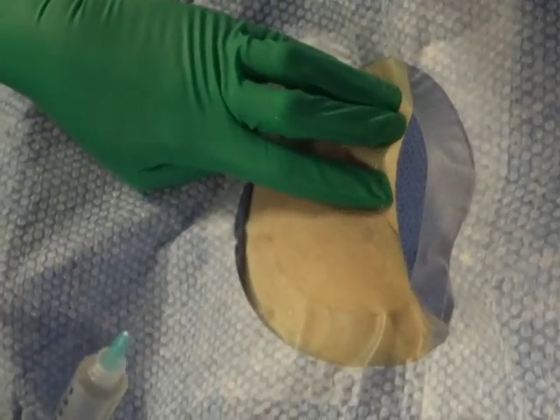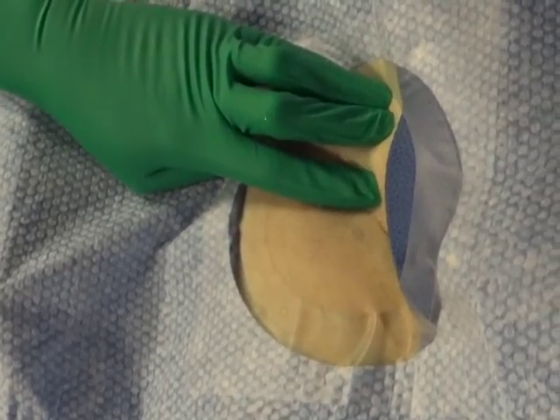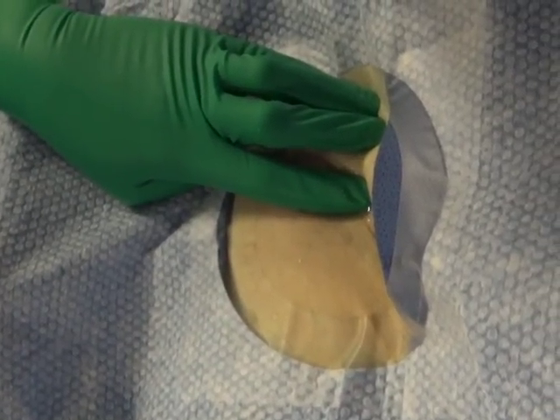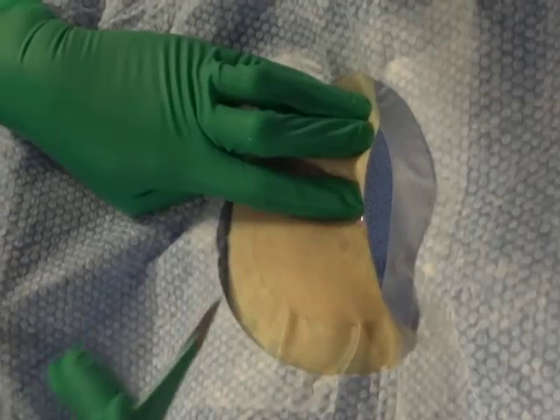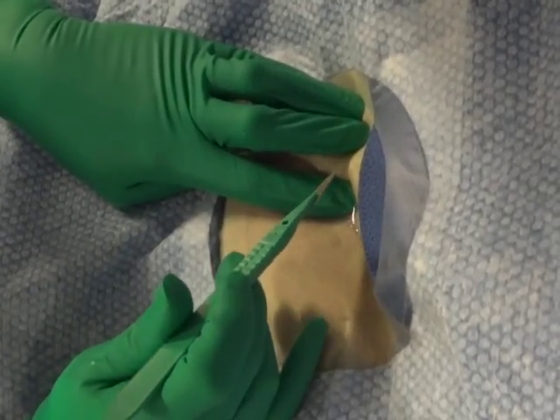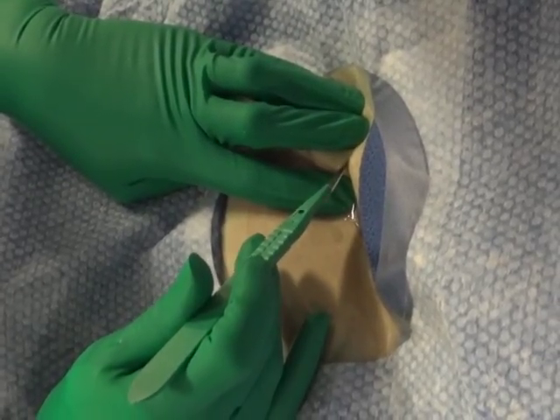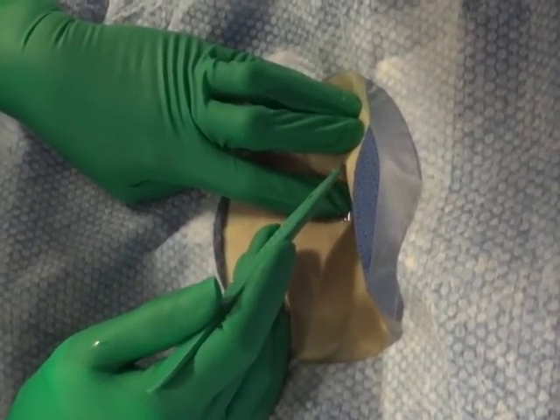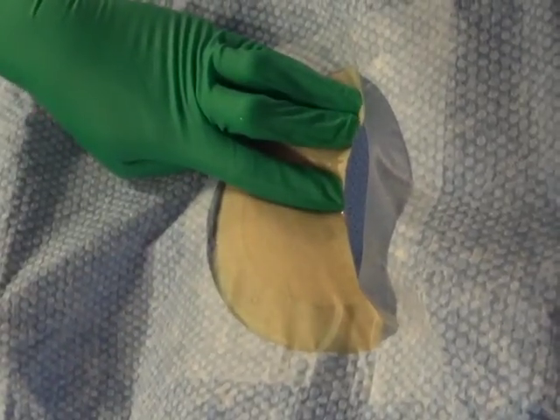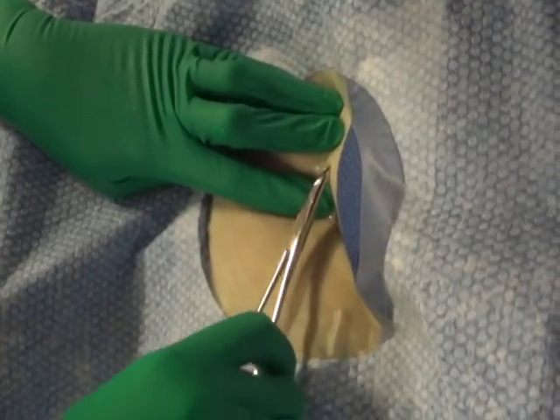to the femoral head. After the surrounding area is shaved, sterilized, and anesthetized, palpate the femoral pulse with 1 finger above the entry site and 1 finger below. Hold the skin taut. Make an incision with a scalpel 1 to 2 centimeters below the intended entry site. Then gently dilate the skin incision by spreading.